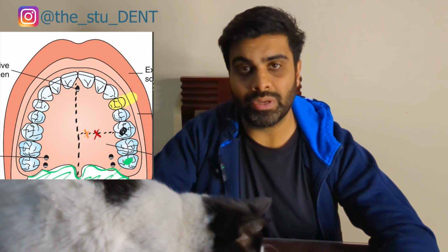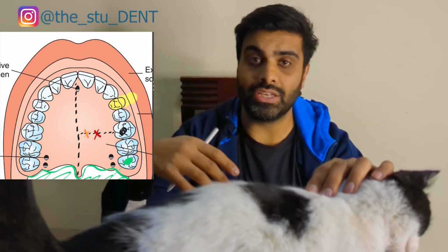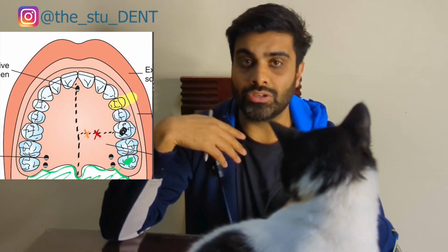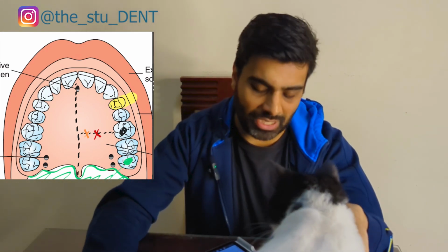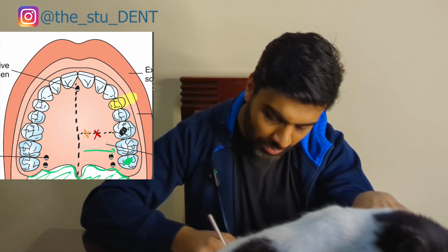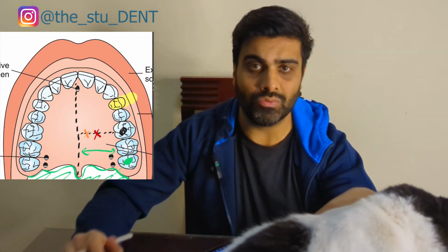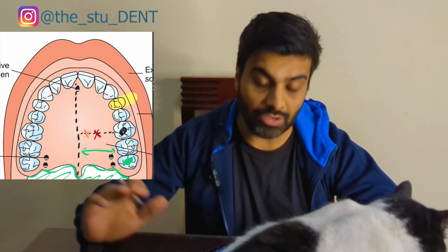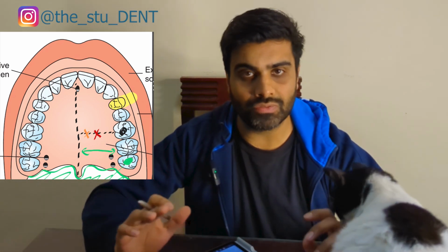That can cause patients to gag or feel nauseous because you lose sensation in that nerve. All of a sudden, that's weighing down in your throat and can just be not very fun for the patient to have. So we stop at the 7. The 7 is the furthest we infiltrate at. That should typically do the trick on the 8 as well, so we don't really need to push as far back as the 8 if we want to get to the 8 anyway.